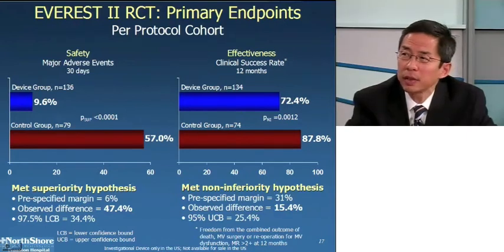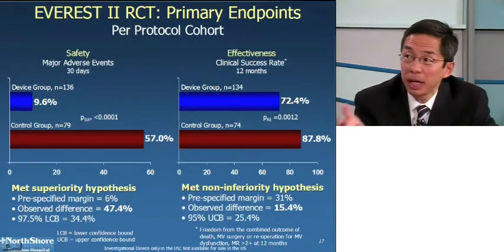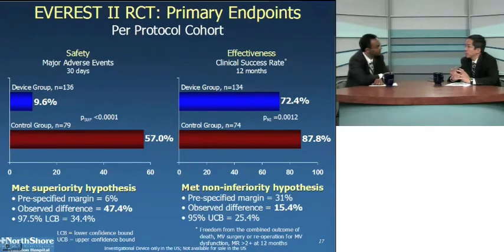And we'll talk a little bit more about the efficacy, particularly when we talk about functional mitral regurgitation, the patient that you described, where I think what we're getting to is a little bit of a trade-off between a safer procedure, particularly for a group of patients that may have a higher upfront surgical risk, even recognizing that all of these patients in the randomized arm had to be surgical candidates. But as we move to talking about patients who may not be surgical candidates, that trade-off may be even more important, where we may be willing to accept a safer procedure with a little less efficacy, but maybe enough clinical efficacy that it's still meaningful.